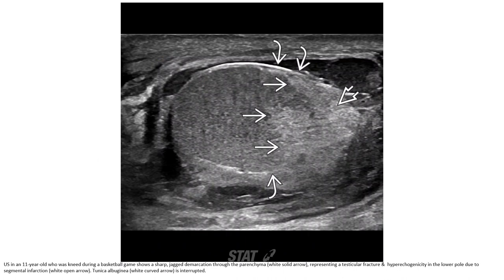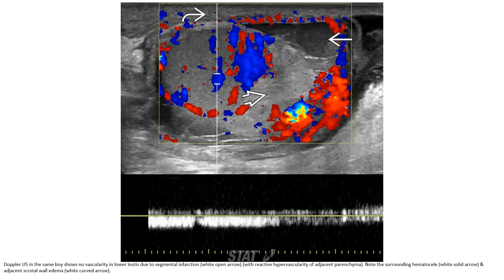Ultrasound in an 11-year-old who was kneed during a basketball game shows a sharp linear defect through the parenchyma representing a testicular fracture, and a hyperechoic area in the lower pole due to segmental infarction. The tunica albuginea is interrupted. Duplex ultrasound of the same patient shows no vascularity in the lower testis due to segmental infarction. Note the surrounding hematocele and adjacent scrotal wall edema.